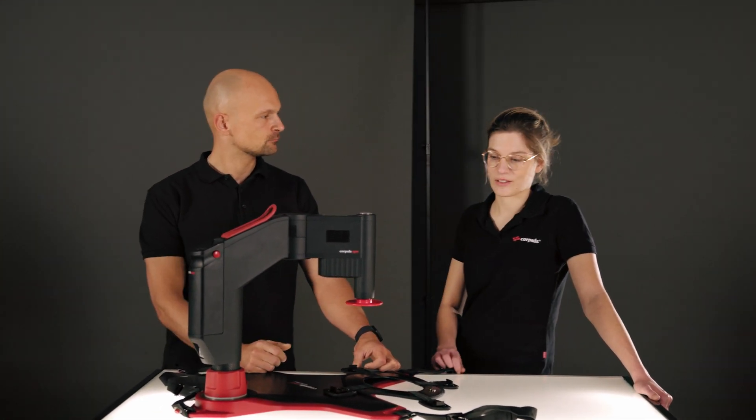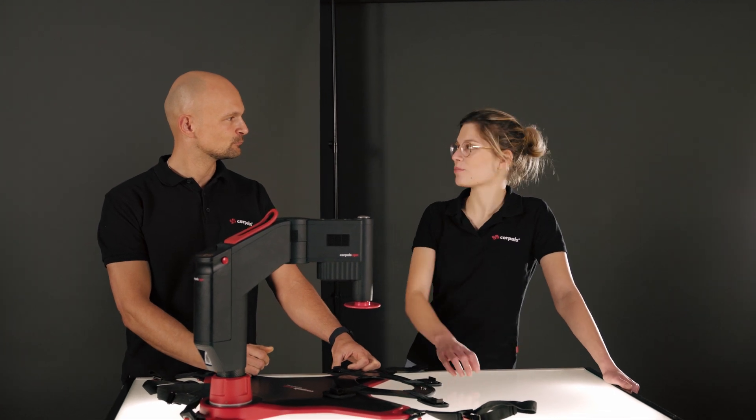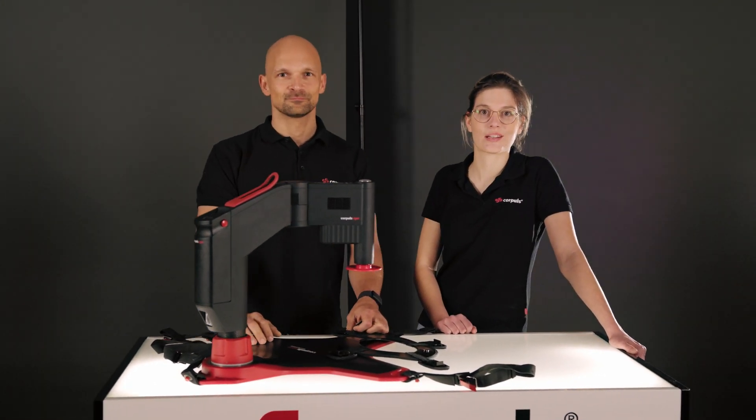Let's get off the podium and over to the mannequin to take a look at the whole thing in practice.